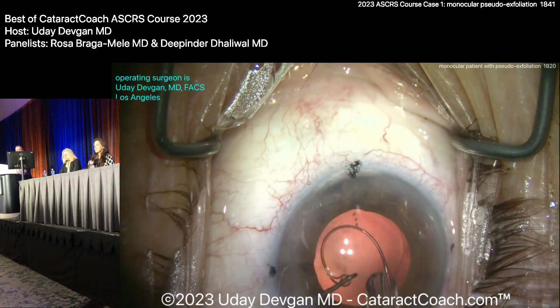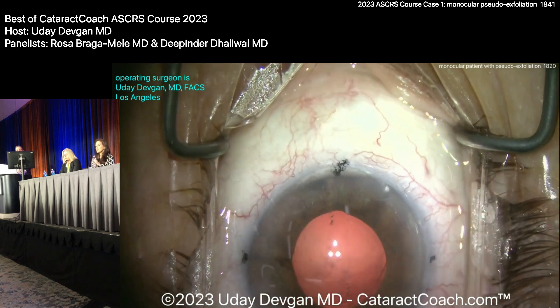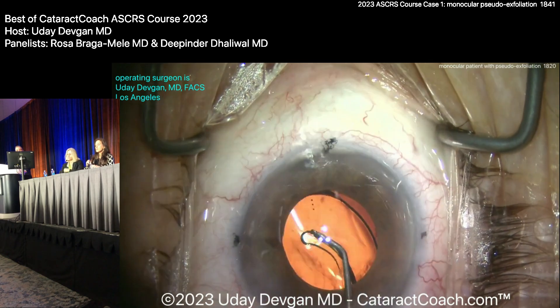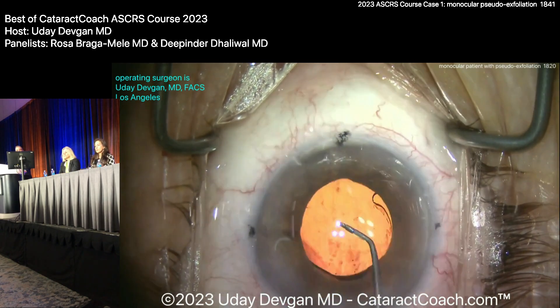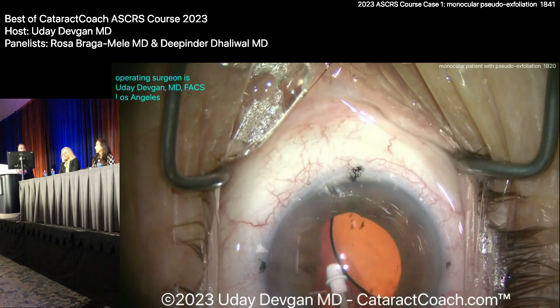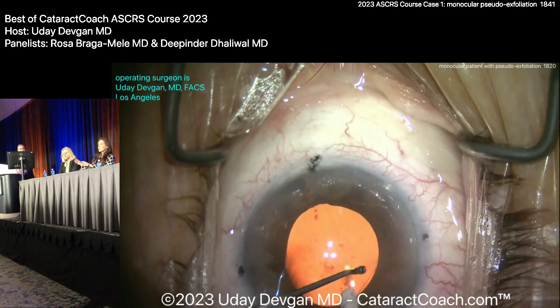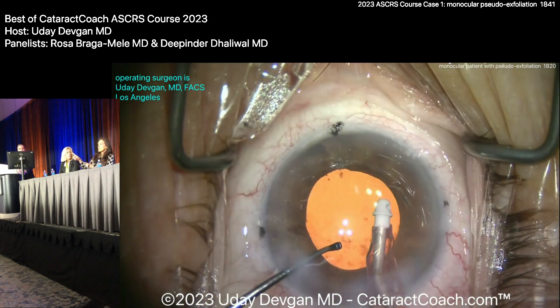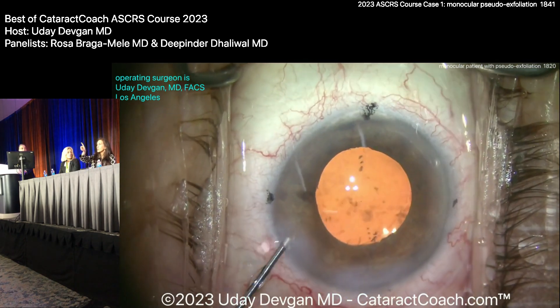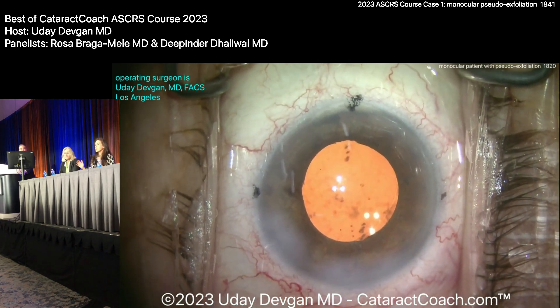I use this method where I'm holding the leading eyelet with the Sinsky and get the CTR dropped in the bag — pretty atraumatic that way. Any pearls on inserting the CTR? I like what Josh Teichman taught me: put it in and start the CTR all the way to the left, using a clockwise CTR, just following the curve of the capsular bag. It's a one-handed technique — so atraumatic and super easy. You don't have to use your second hand.